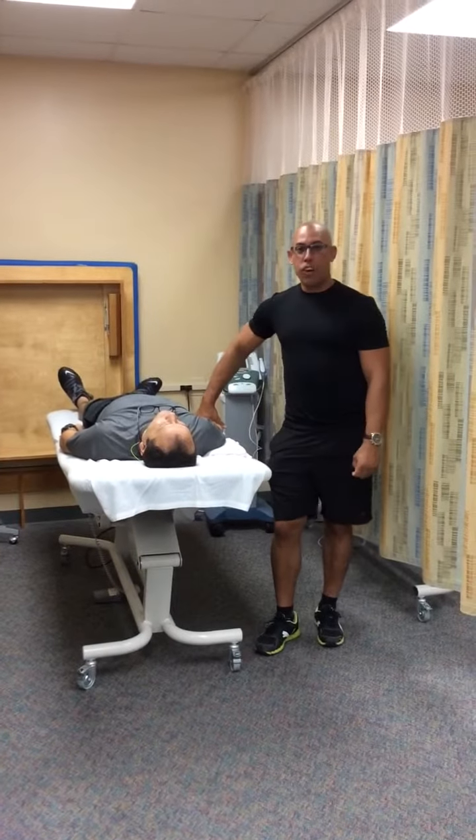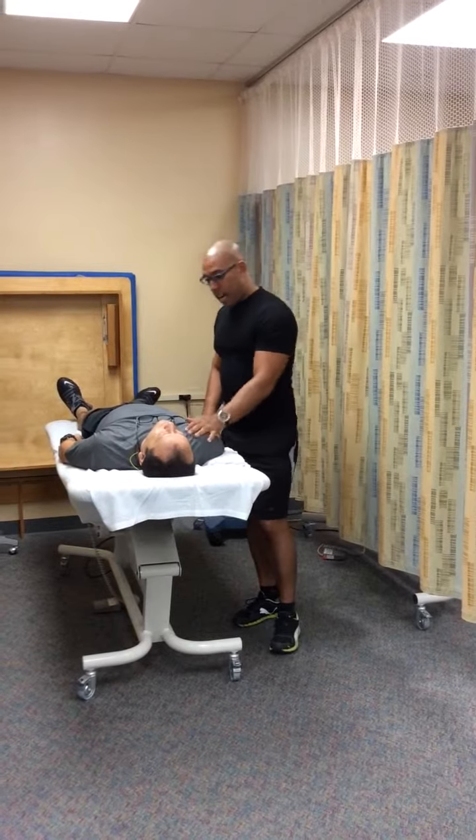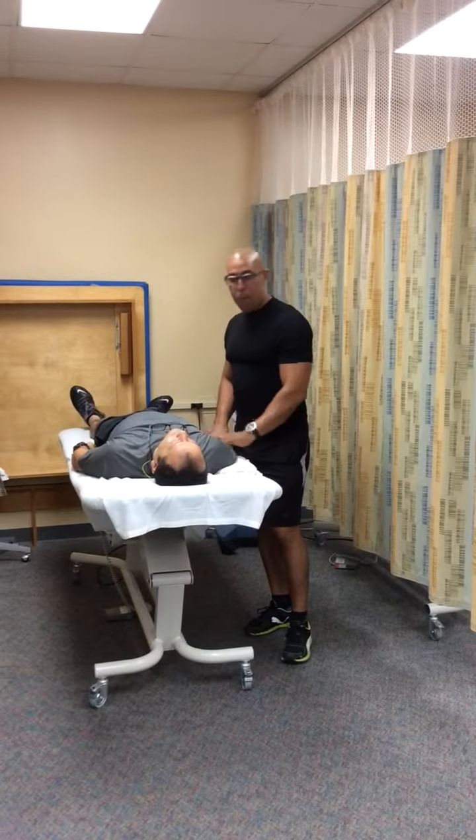Hi, I'm Alejandro at Miami Tech College in the Physical Therapy Assistance Program. And today we are going to make a measurement of the elbow flexion.